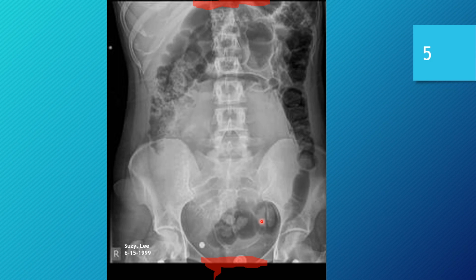So with that being said, is all of our anatomy present? Well, it's kind of difficult to say in terms of kidneys, and the reason for that is really what I wanted to touch on when we began this unit, artifacts. We'll get to that in a moment, but definitely not an easily or readily identifiable kidney area. I don't think there's any helping that.